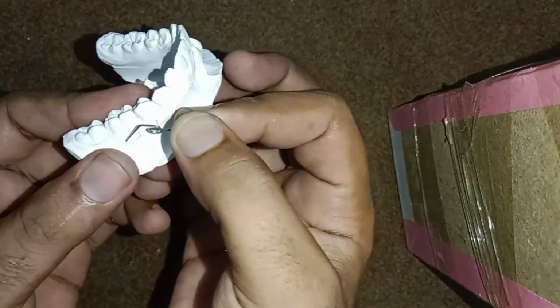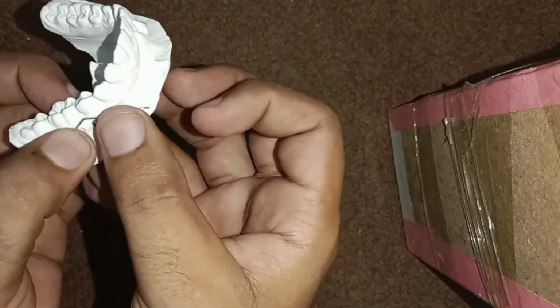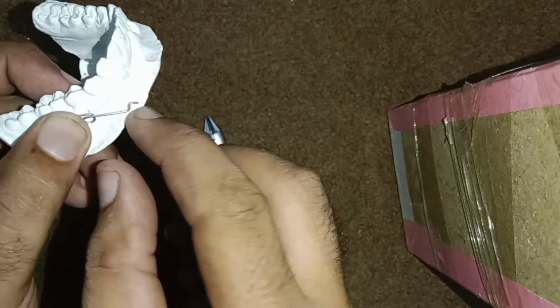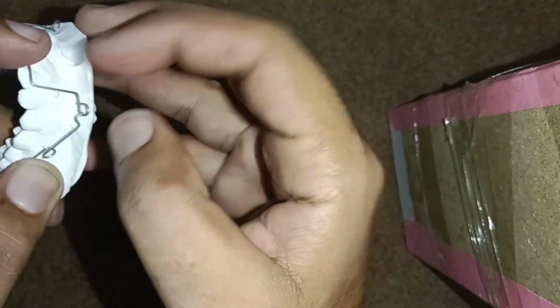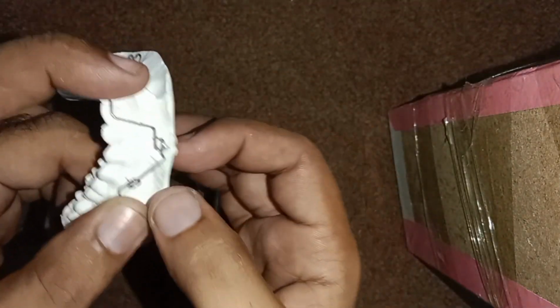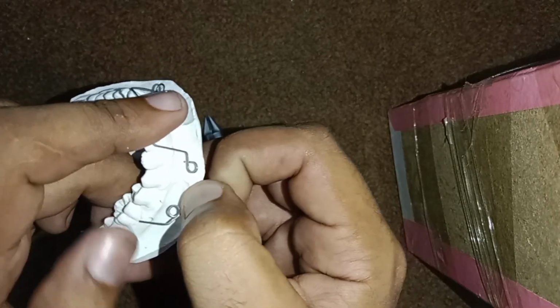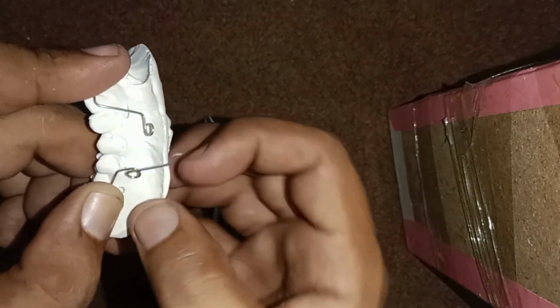This we will place in the accessory tube of the first molar. It will lie downward. We will bring it up and place it in the loop that we have formed of the anterior segment's loop. This piece will lie downward.